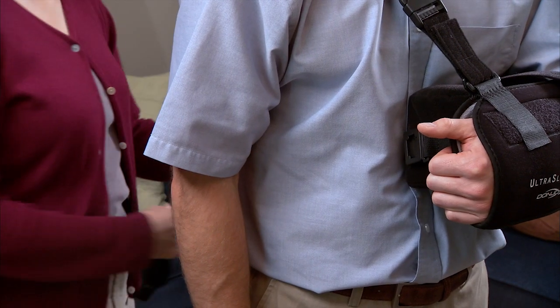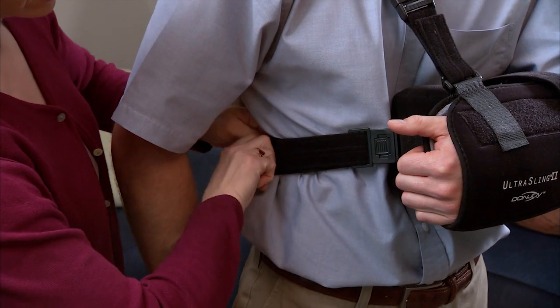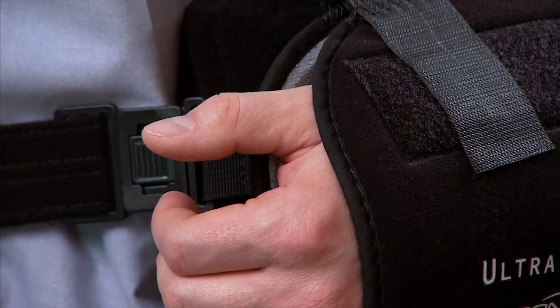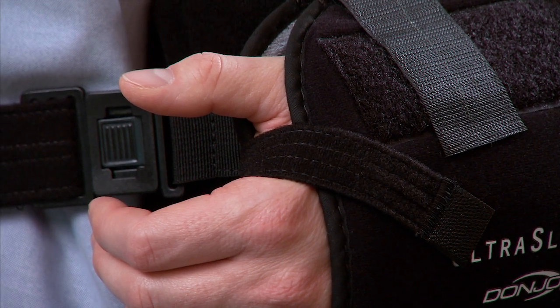Your arm should be bent at the elbow at a right angle. This takes stress off the shoulder muscles. Your helper loops the waistband around your back and fastens the clasp to adjust it for a snug fit. This helps keep your wrist at the midline of your body. Finally, your helper attaches a short, thin strap under your thumb to help keep your arm in the sling.